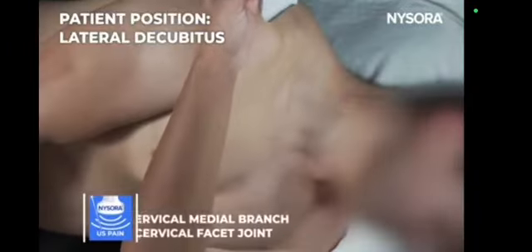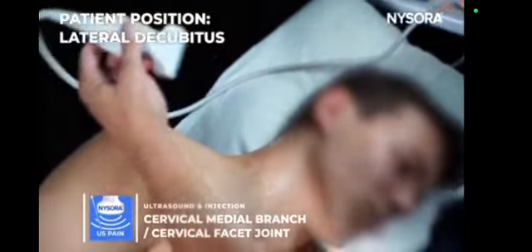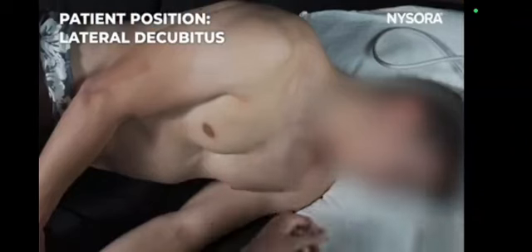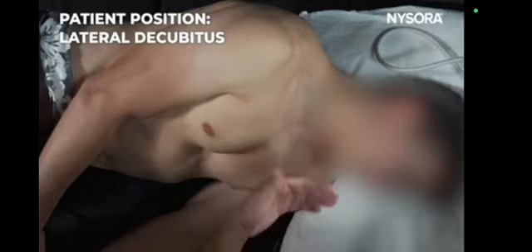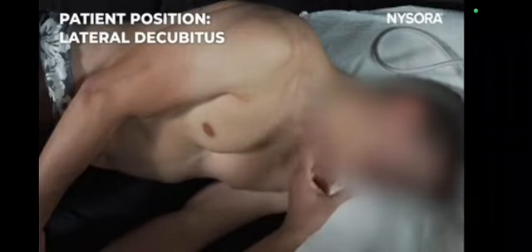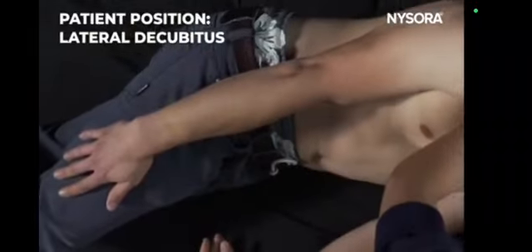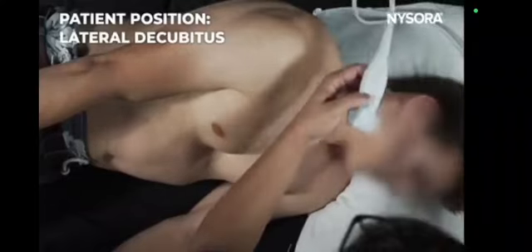So I'm going to show you how to scan for the cervical facet joint injection and the cervical facet joint medial branch block with the patient in the lateral position. So, position: lateral, and use a pillow under the shoulder. If the patient has a short neck, you want to ask the patient to reach out for the knee. That way you can pull the shoulder down. That gives you the maximum operating area.